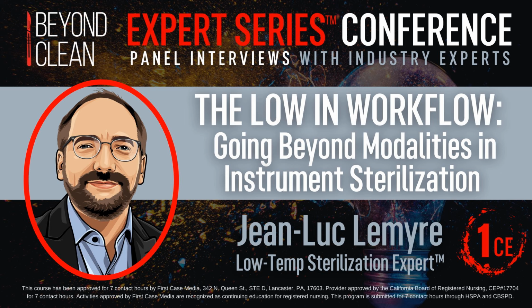So circling back around to your answer, I heard a lot of elements that sound similar to the way a pre-vac sterilizer in steam would work. You've got conditioning of the chamber with a vacuum, we're injecting this sterilant and steam, I suppose it would be high-pressure saturated steam, you've got contact with all the instruments, and then we're vacuuming it out. So can you highlight what are some of the differences in what's going on in that chamber between low-temp sterilization and steam sterilization? Because I'm sure they work in totally different ways.